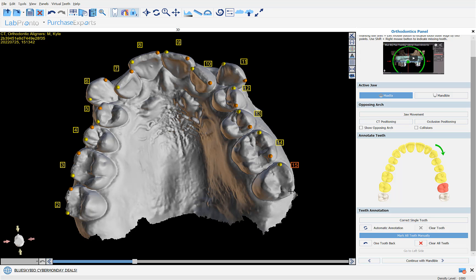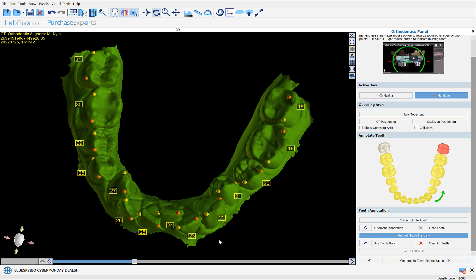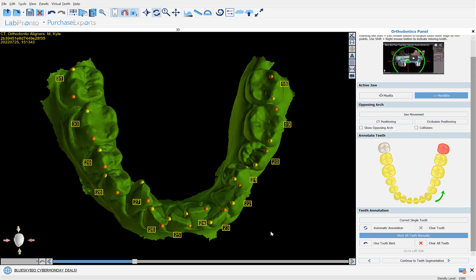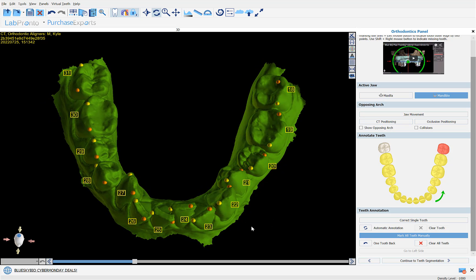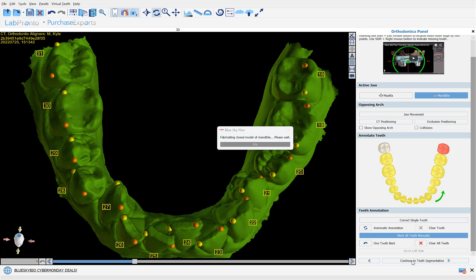We're going to right-click to indicate the missing tooth and click continue with mandible. For the mandible, the automatic annotation is done successfully. There is no real need to adjust the positioning of the annotations, so we're going to click continue to teeth segmentation.